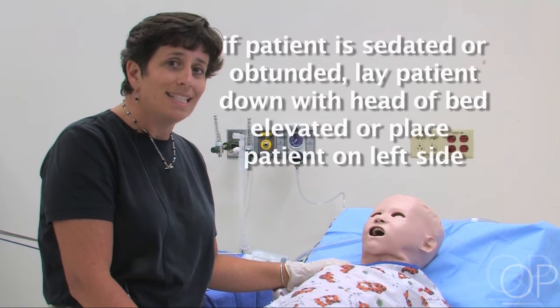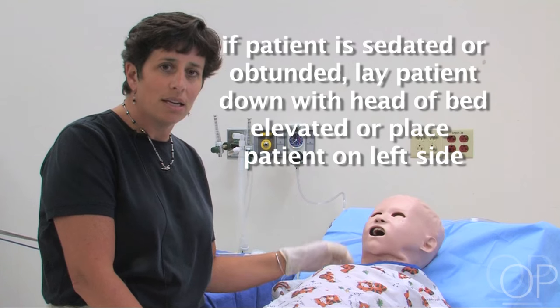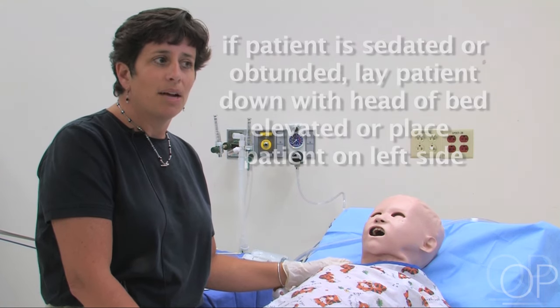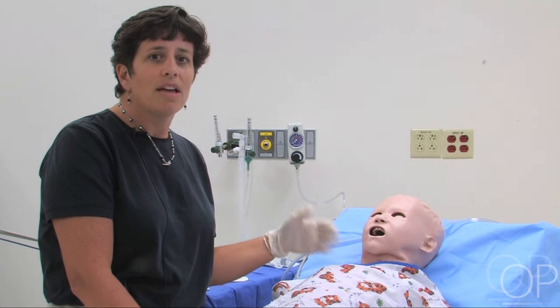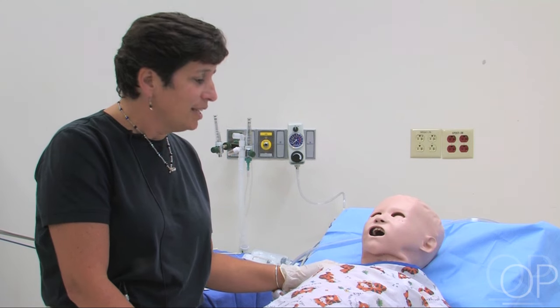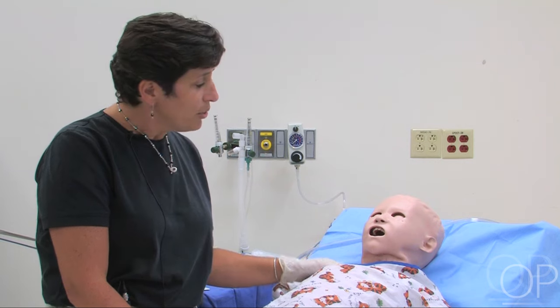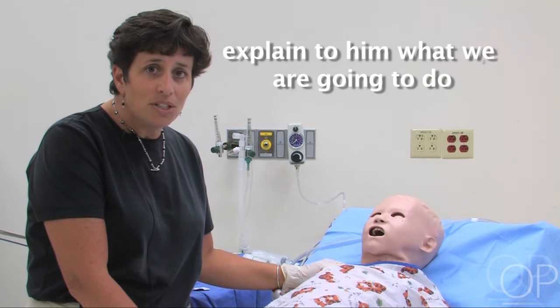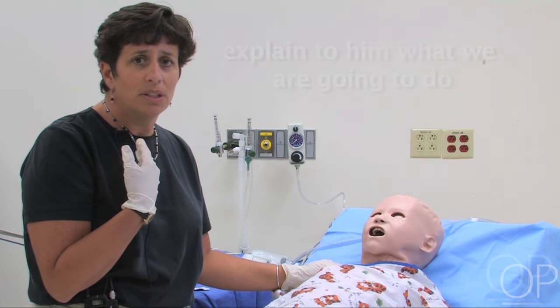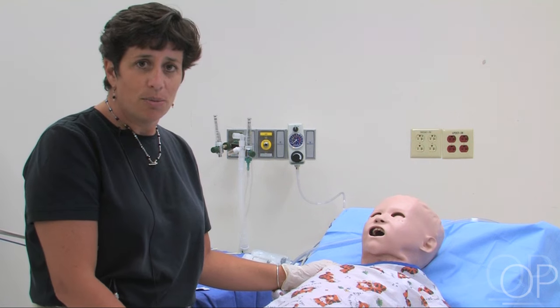If the patient is sedated or obtunded, the safest way to do this would be to lay the patient down a little bit, still with the head of the bed up slightly, and potentially place the patient on the left side. That way, if the patient vomits during the procedure, they will be safer to not aspirate. This patient today is awake and alert and willing to cooperate. I'm going to explain to him what we're going to do — putting a tube down his nose will feel uncomfortable going down, but once it gets past his throat he shouldn't really feel it so much anymore.